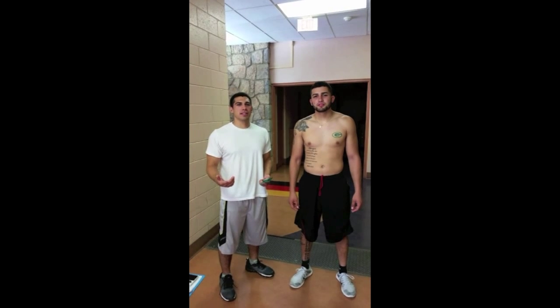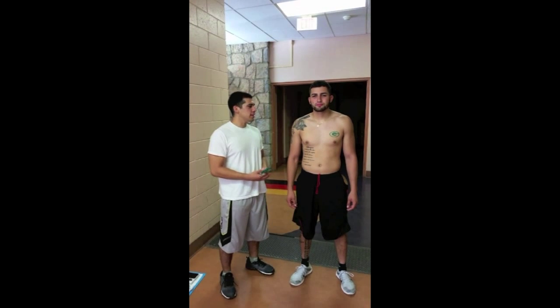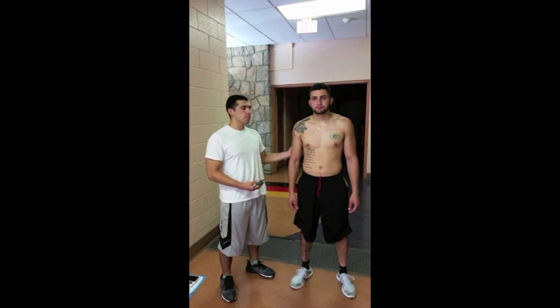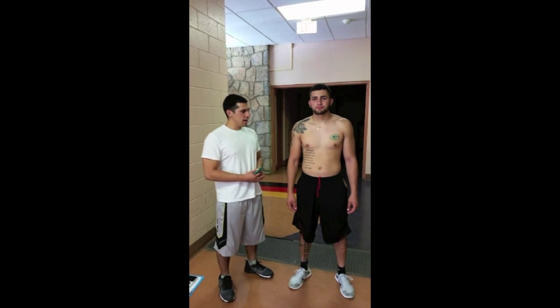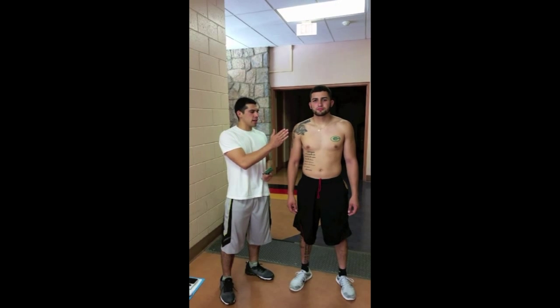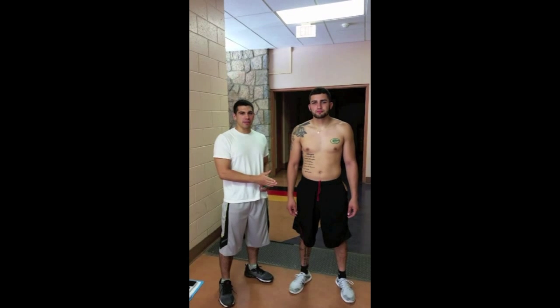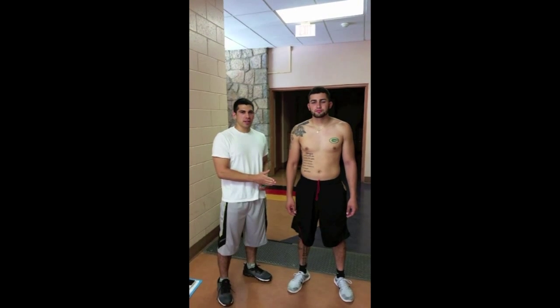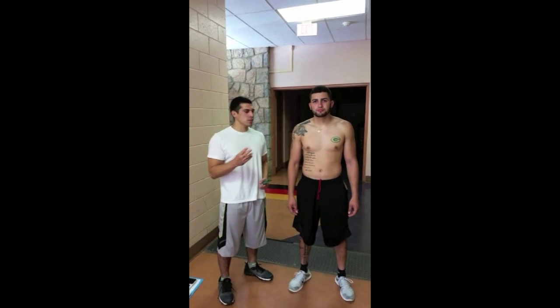When conducting a 7-site skin fold testing, the participant needs to be standing in an upright position and measurements will be taken on the right side of the participant's body. There will be 2 trials when conducting the 7-site skin fold test. When measurements are being taken, the pinch of the skin should be maintained and you should wait no longer than 1 to 2 seconds before reading the caliper. The sites that will be measured are the abdominal region, triceps, chest, thigh, suprailiac, mid-axillary, and subscapular regions.